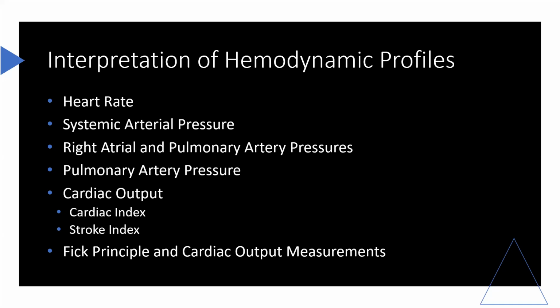PA pressures can be monitored continuously through the distal lumen of a PA catheter. Left atrial and ventricular pressures can be measured intermittently during PAOP determinations. PAOP determinations represent retrograde pressure measurements that are obtained by inflating the balloon of the pulmonary artery catheter until it occludes a small pulmonary artery and wedges to block blood flow past the catheter tip. As mentioned previously, PAOP measured at the end of ventricular diastole reflects left ventricular end-diastolic pressure because the mitral valve is open and the pressure in the left ventricle is transmitted backwards into the pulmonary circulation to the catheter tip.